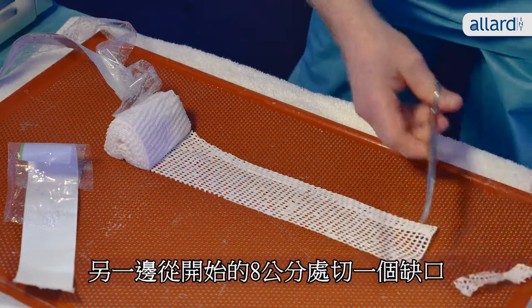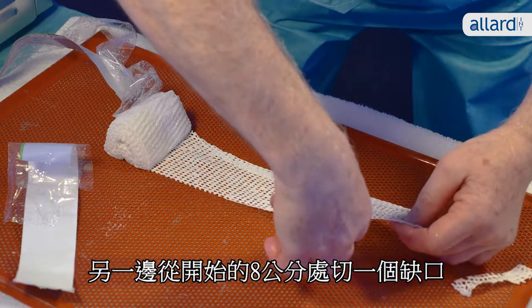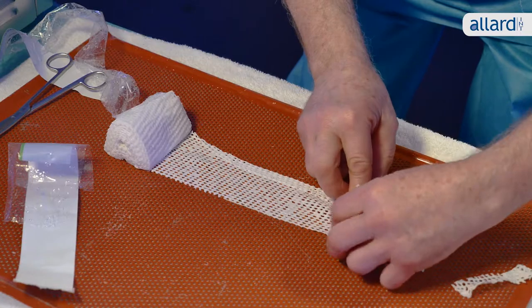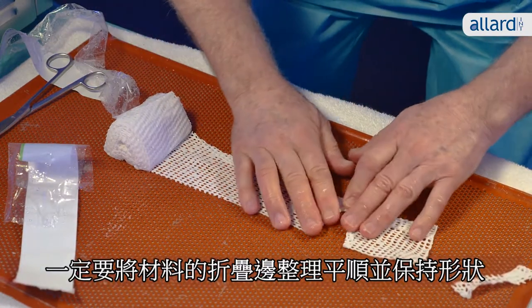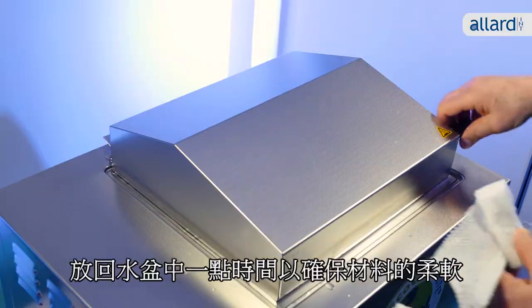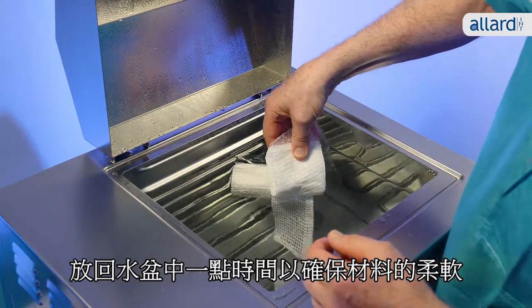Make a 1 cm wide fold on one side. On the other side, approximately 8 cm from the beginning of the roll, cut a notch and fold back the material. Make sure to smooth out the folded material to keep it in place. Put the roll back into the water bath for a short while to make sure the material is soft.